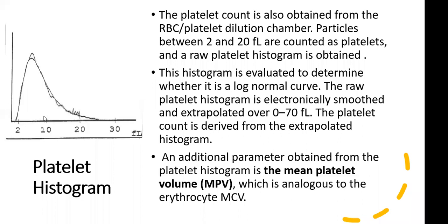Whenever the platelet count is obtained by the impedance method, the histogram is generated and corrected. There is a caricature or skeleton of the histogram already in the machine, and the platelets derived from a particular sample are extrapolated onto that skeleton.